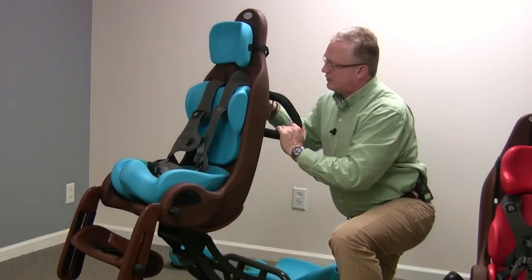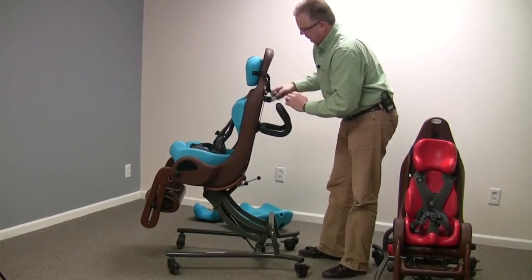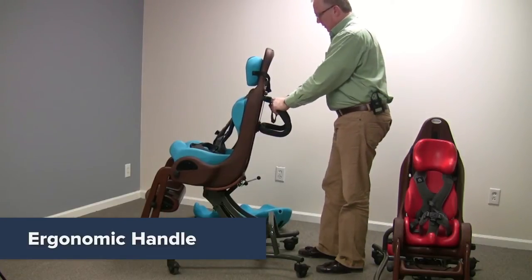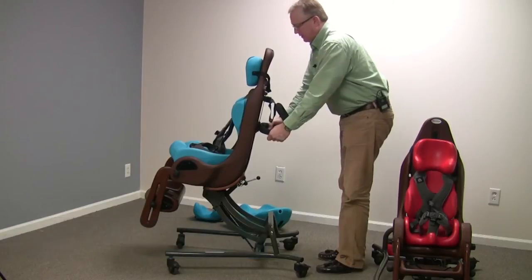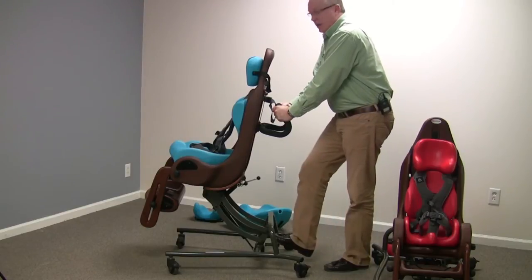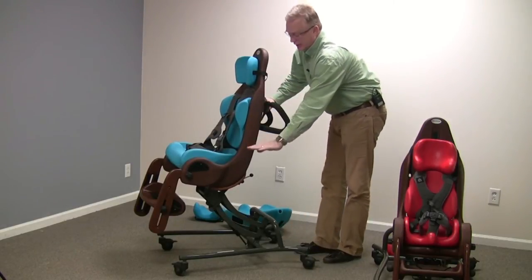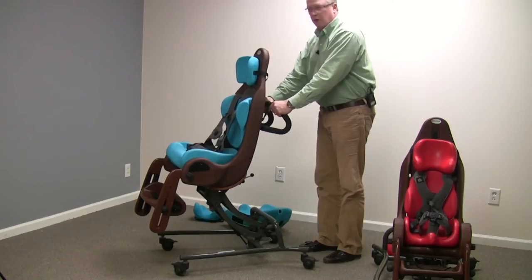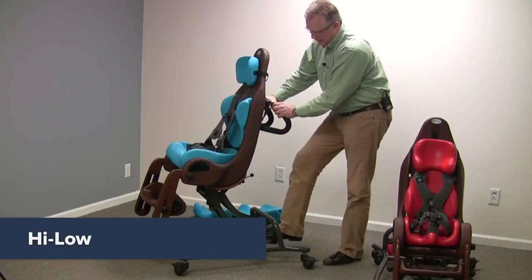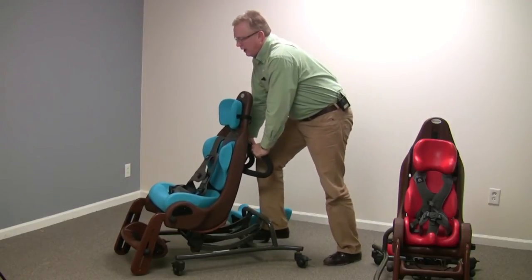The MPS High-Low seating system has a couple of really nice features. One is the belting system; the other is the ergonomic handle. It's nice and high — you can grab it up high, down low, or on the sides — which is great for transporting the person in the chair. We always recommend lowering the seating system to the lowest comfortable position when transporting somebody from one room to another. To adjust the height, there is a pedal that you step on and the seat comes all the way down to the floor.